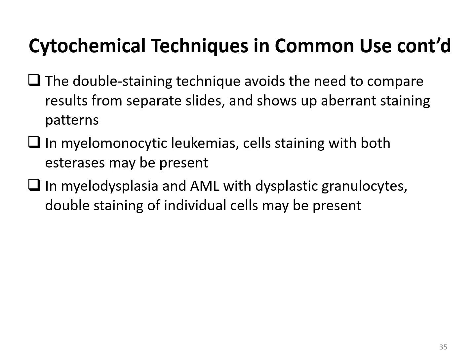As we have mentioned, it's really difficult to identify the different cells because they are not really normal. Even experienced pathologists would have difficulty identifying them. So by using stains, it will be possible to identify the myelocytic series and even the other hematopoietic cells.